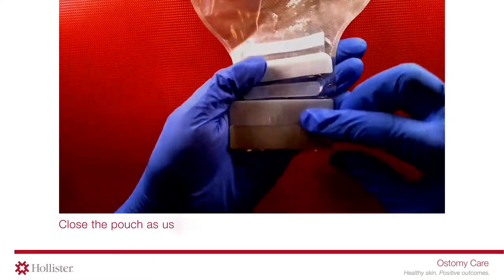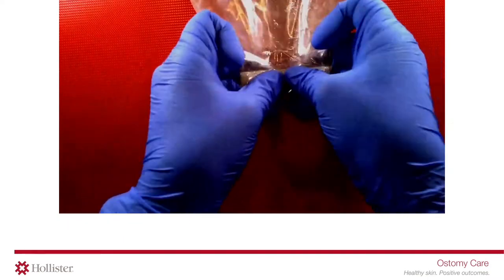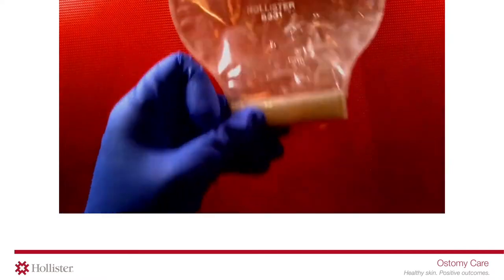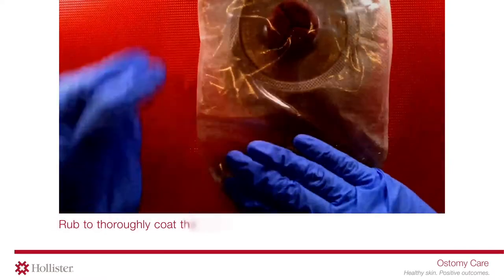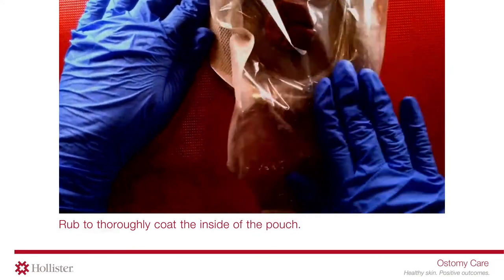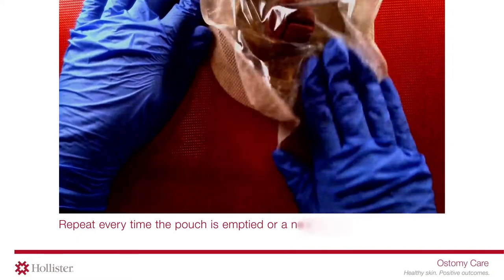Close the pouch as usual, then rub to thoroughly coat the inside of the pouch. Repeat every time the pouch is emptied or a new pouch is applied.